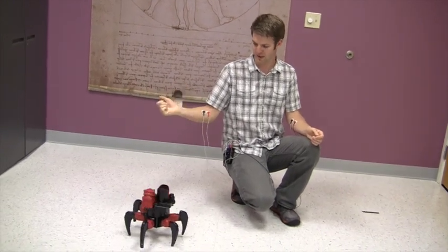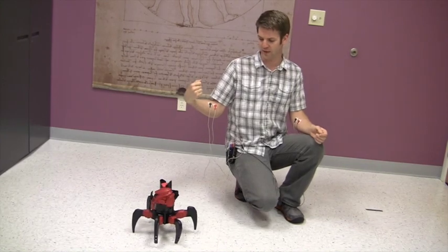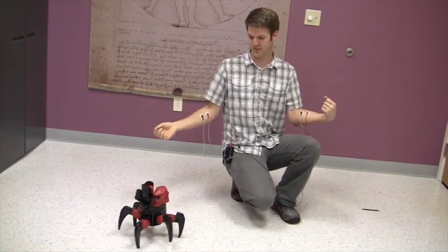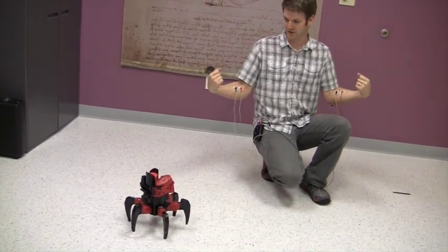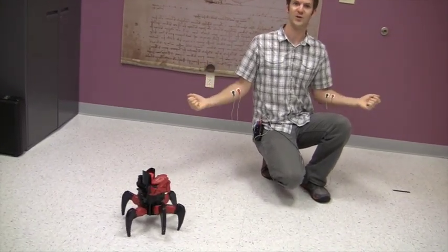If I flex one muscle, I can control the direction the robot's facing. Flex the other, and make it move in that direction. If I flex both muscles, it shoots.